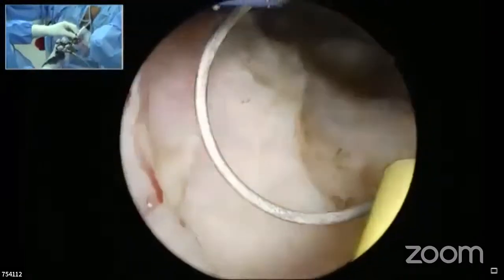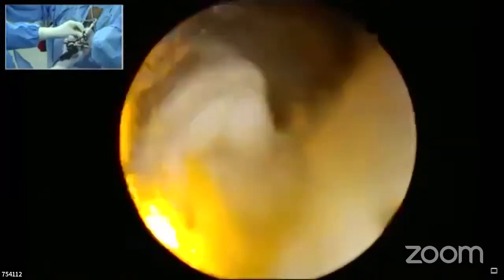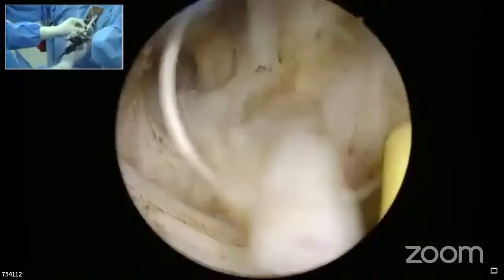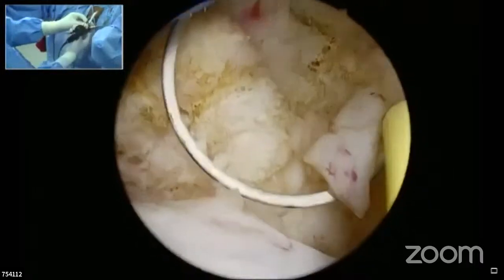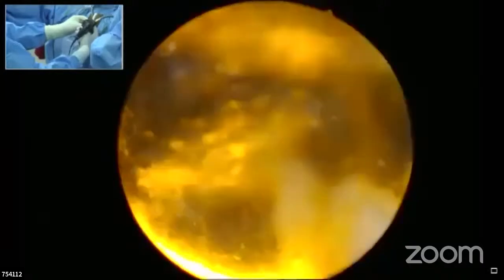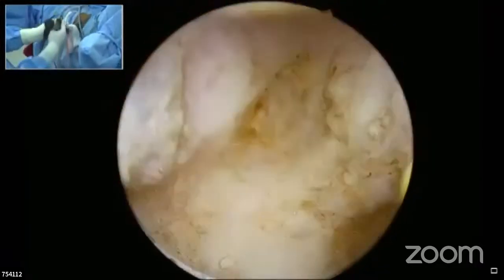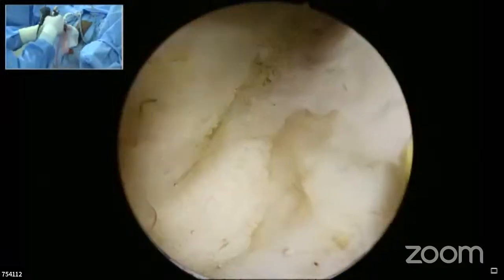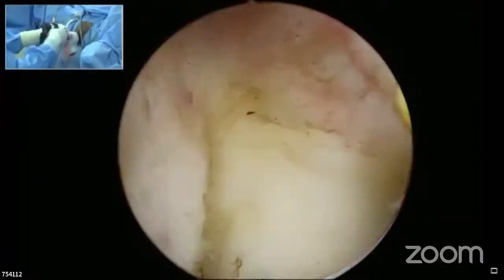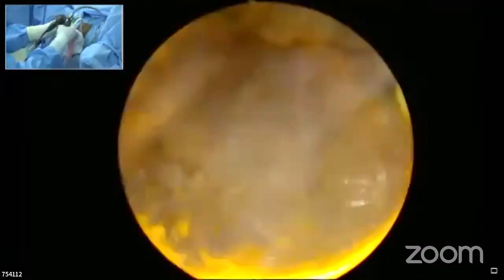Yeah. And now coming to another question, I would like to give my comments also. Scooping of the prostate, what you have mentioned, Dr. Mallikarjun, should be done here so that the mucosa is preserved. I come up to the mid of the verumontanum. I don't go beyond the mid of the verumontanum. In that, most of the cases can be managed. And you just resect the low prostate only. Don't resect the mucosa there.